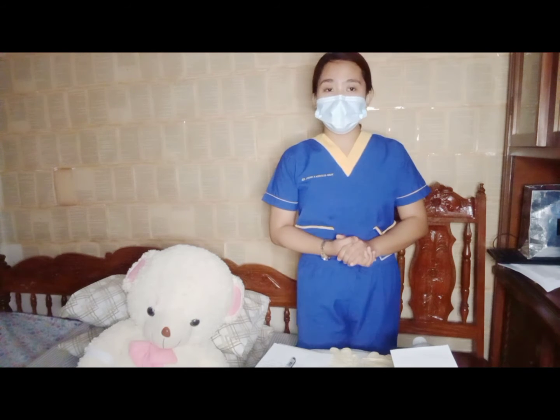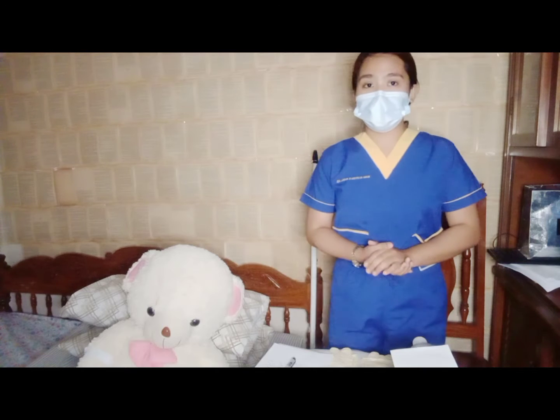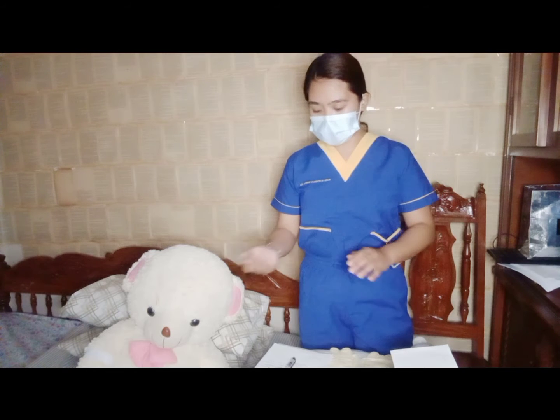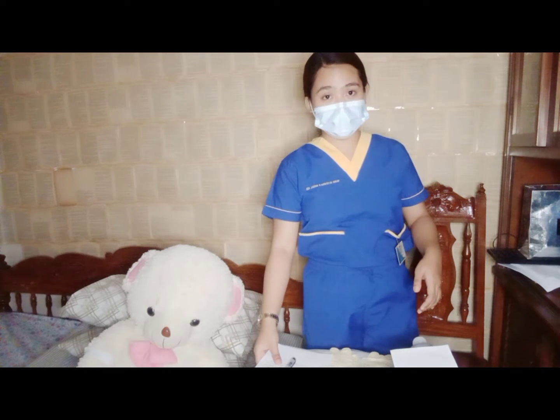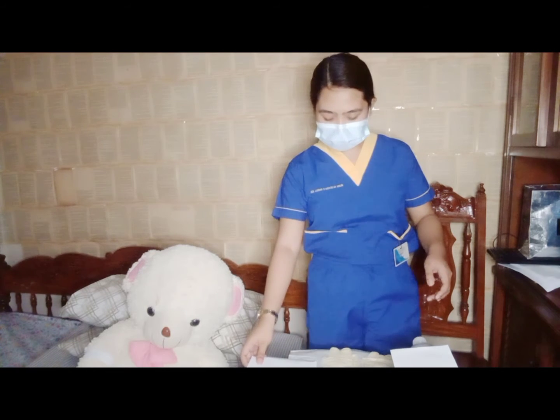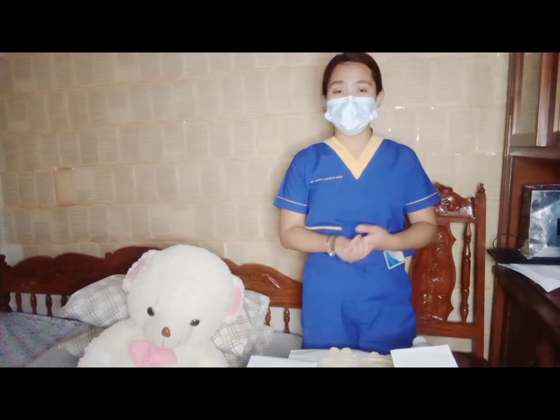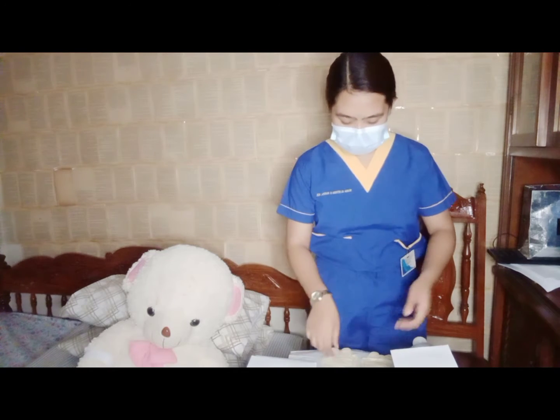This is the final opportunity to avoid the fatal mistransfusion. Okay, so after validating the data, we will wear gloves to avoid contact with blood.